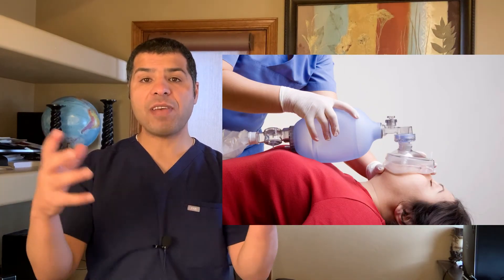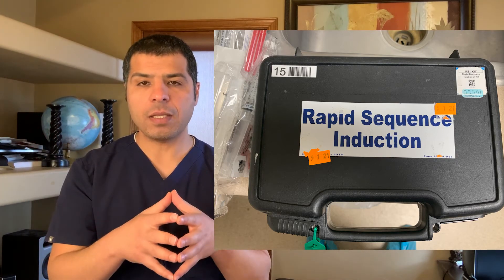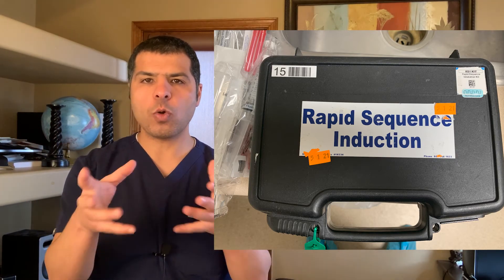You also need an ambu bag or bag-valve-mask ready, and a CO2 detector to confirm correct ET tube position. Monitor-wise, the patient needs pulse oximetry, end-tidal CO2 if possible, heart rate, heart rhythm, and blood pressure monitoring. Have a crash cart on standby — sometimes with a crashing patient you should place pads and be ready. Finally, you need RSI medications to sedate and paralyze the patient.